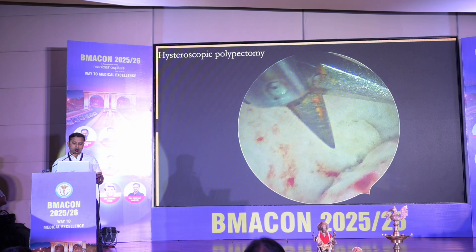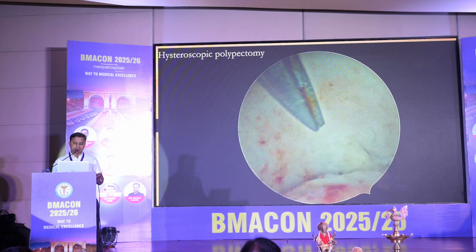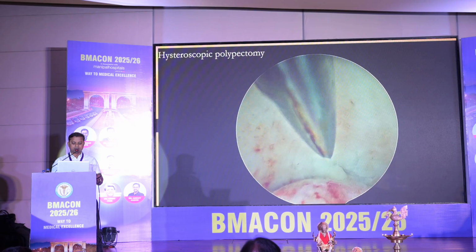Now this is hysteroscopic polypectomy. A small polyp 2 by 2 centimeters. It was removed with the help of scissors.